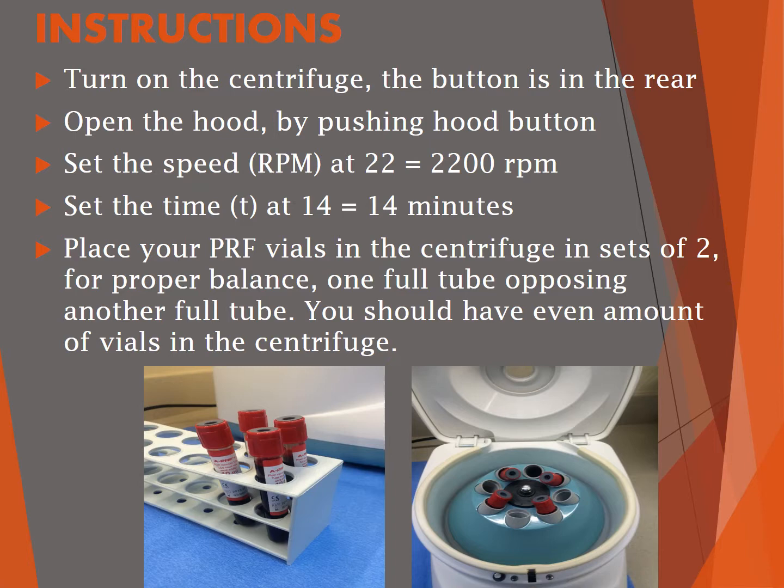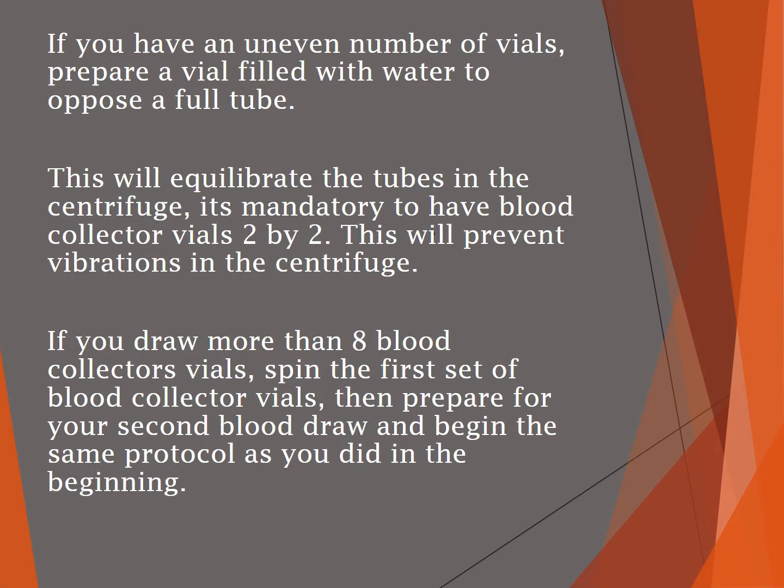You should have an even number of vials in the centrifuge. If you have an uneven number, like five, it's a good idea to prepare a vial filled with water to oppose the other full tube. This keeps everything in balance, as it's mandatory to have the blood collector vials two by two, opposing each other, to prevent vibrations in the centrifuge.